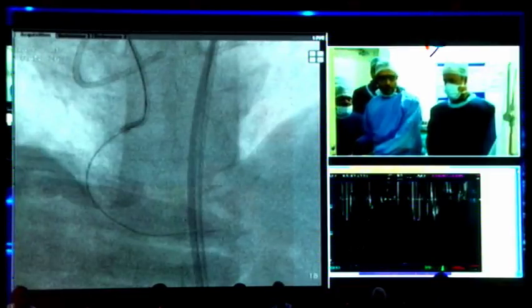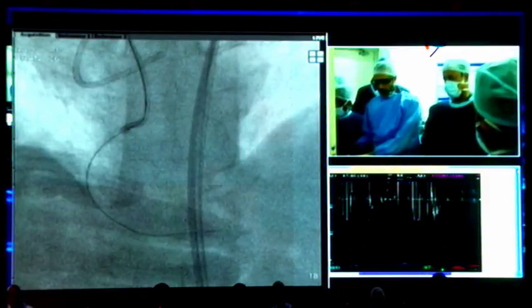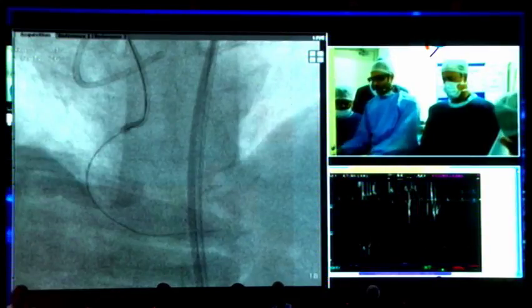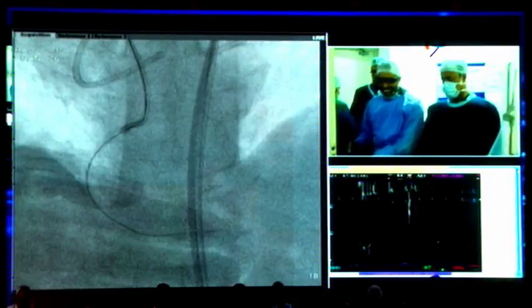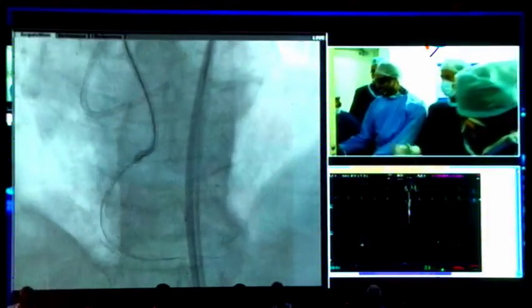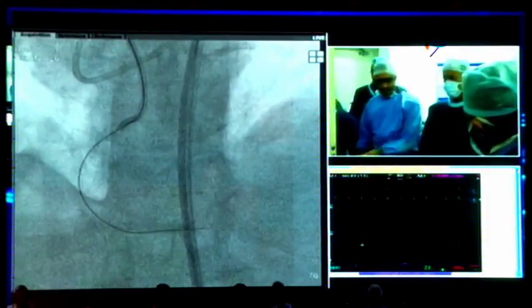Dr. Asakura, any comments from you? Dr. Asakura is probably thinking, go retrograde. I probably will. I should. Okay, move the table up. Yeah, thank you, guys.